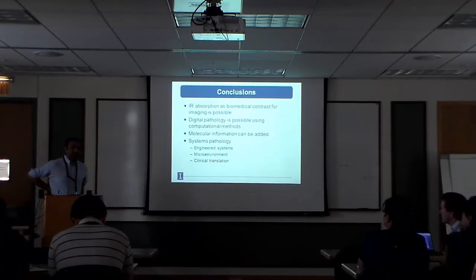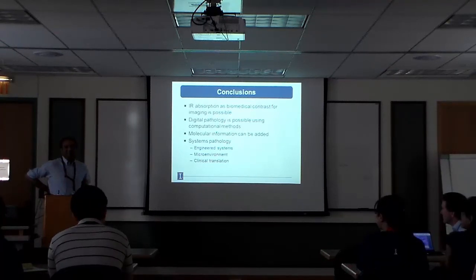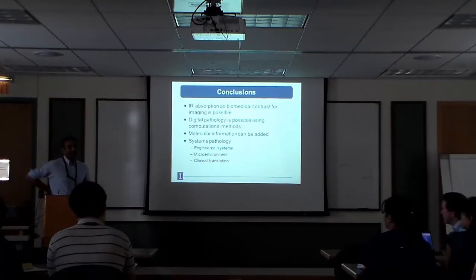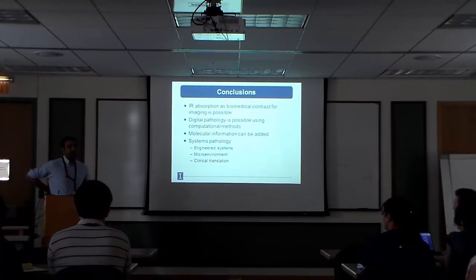And the best methods we've found are people say, oh, mix it quickly at 37 degrees and put it in the fridge at 4 degrees and keep it there for 27 minutes and then bring it out and blow on it and then put it back for 2 more. I mean, it's just a recipe. So collagen is so variable that I just don't think you can do it with collagen. With synthetic polymers, I think you can, and there's well-known ways to do that.